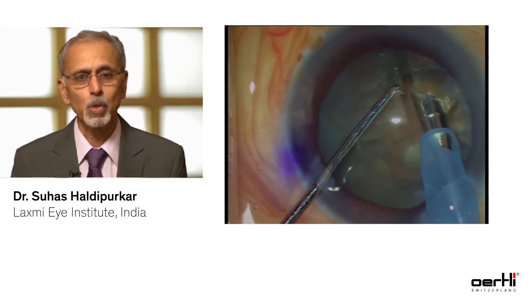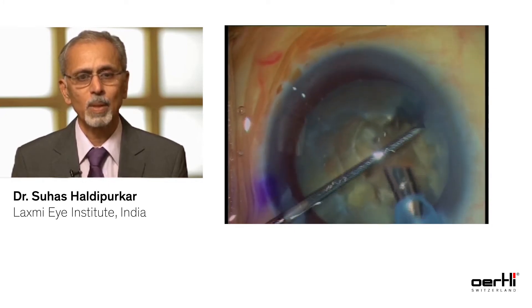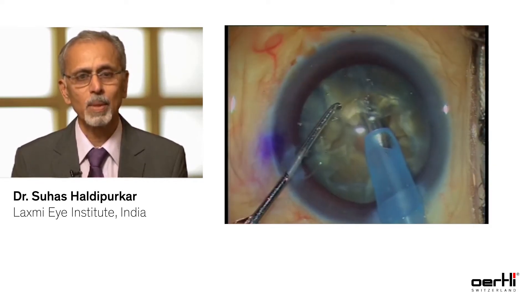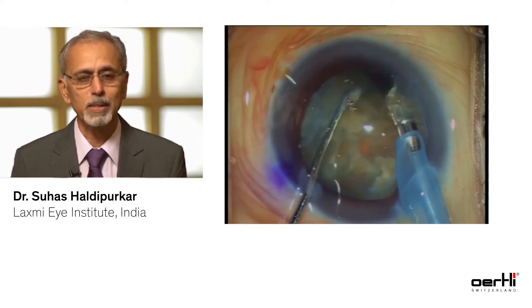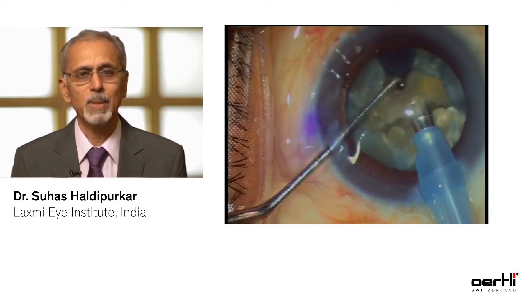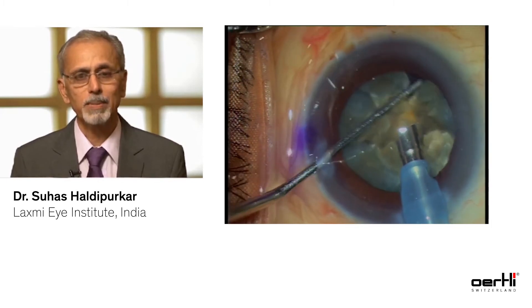What you see here is a vertical chop. The fragments are held firmly with your phaco tip, and with the chopper they are split into smaller and smaller pieces. Once you have converted them into small pieces, you start emulsifying them.